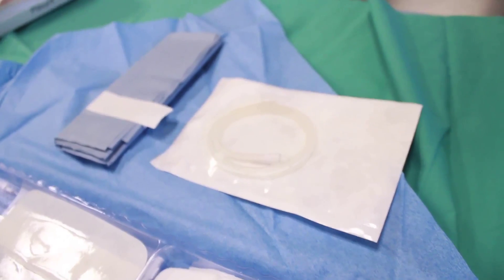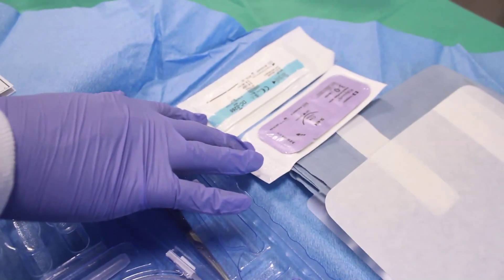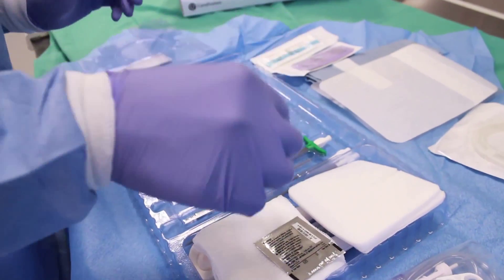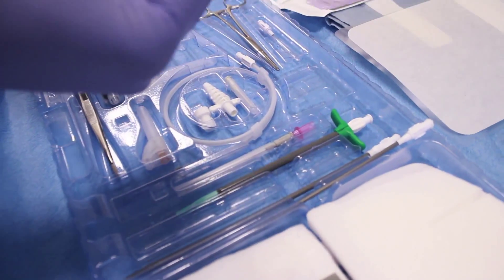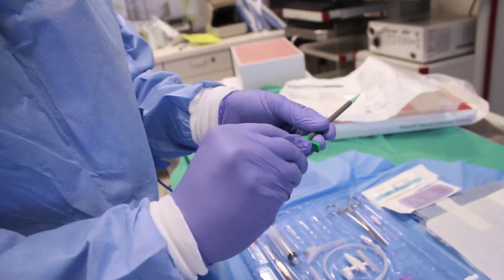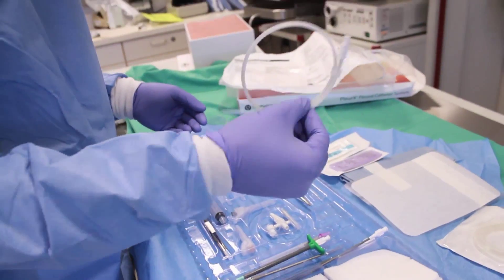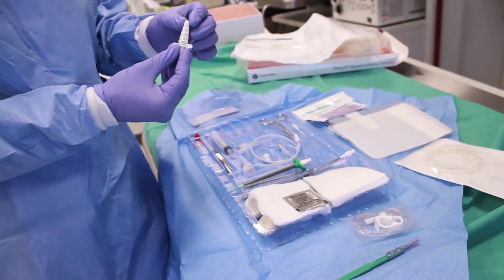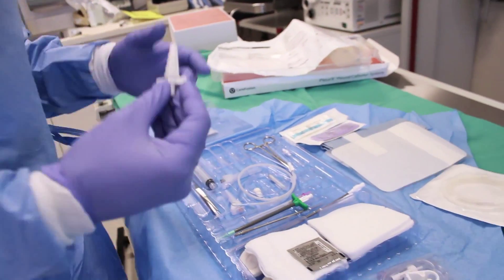The pleurex catheter is the tunnel catheter placed in the patient's pleural space. It comes with its own dressing, two different types of needles — both curved and straight — to help secure the catheter, and important dilators in both 8 and 12 French sizes. It also includes a tunneling bar to help tunnel the catheter, an introducer with a tear-away sheath, a guide wire, and different needles for insertion. There is also a Christmas tree connector for attaching the pleurex to a vacutainer or a pleural vac.